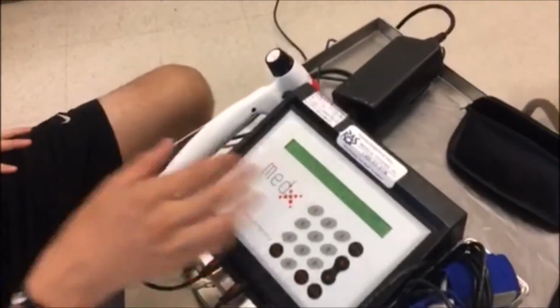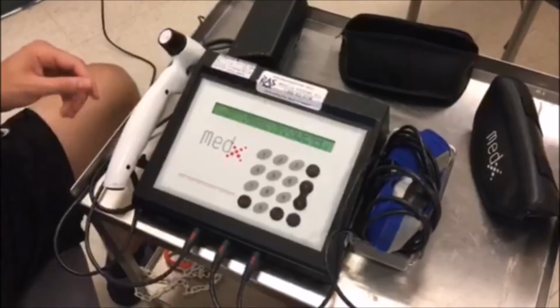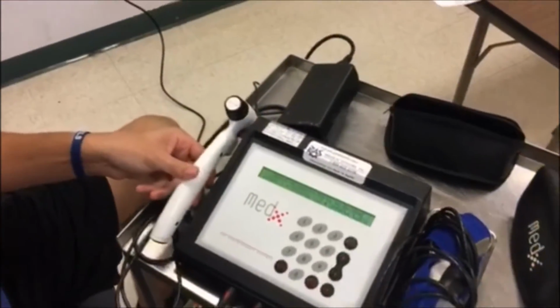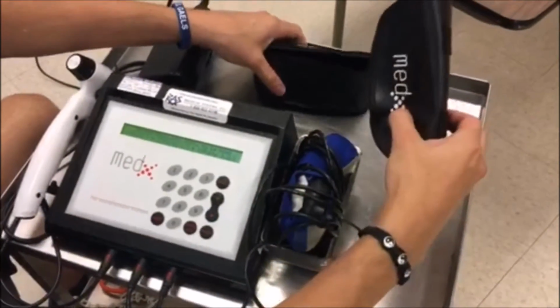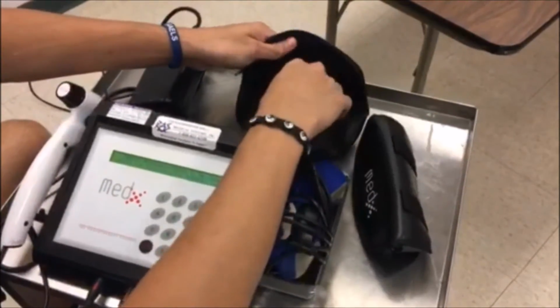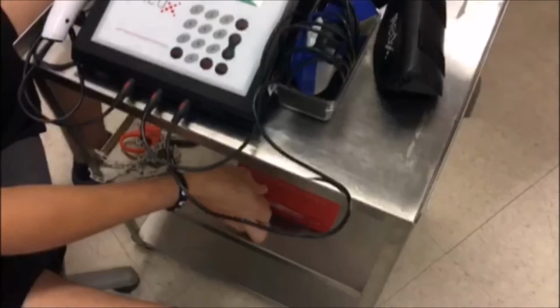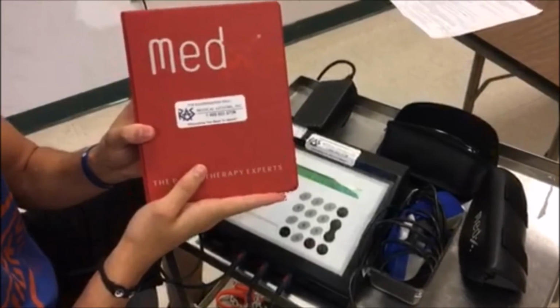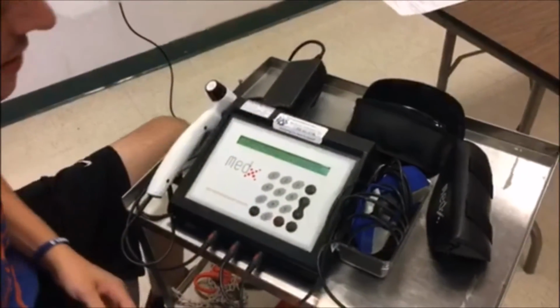Okay, so now before we jump into what the menu reads here, I just want to point out some of the items for the machine. Here we have our laser gun. We have our 2 SLD pads here. We have our goggles, which are very important for the eyes, one for the patient, one for the clinician. And we have a menu down here. If need be, the clinician can go more in depth into various pathologies in case they forget how to treat it or what the parameters are.